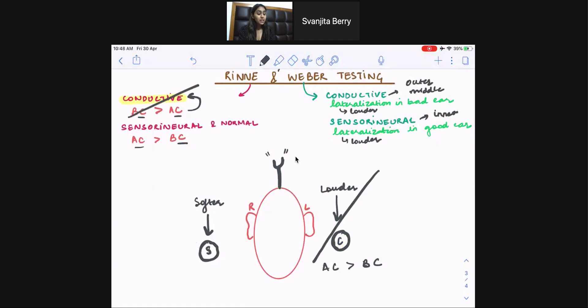What that means is now I have to accept the other alternative, which is there is a sensorineural hearing loss in my right ear. So when I do the Rinne testing in this ear, I should already know what to expect. I'm going to expect air conduction, greater than bone conduction in my right ear, and that represents sensorineural hearing loss. Since this ear, they're hearing softer compared to the left or the good ear.